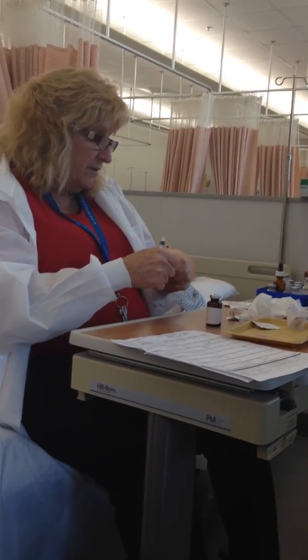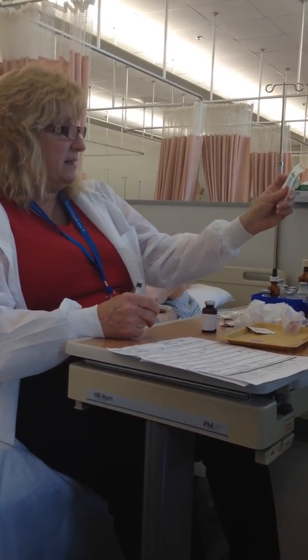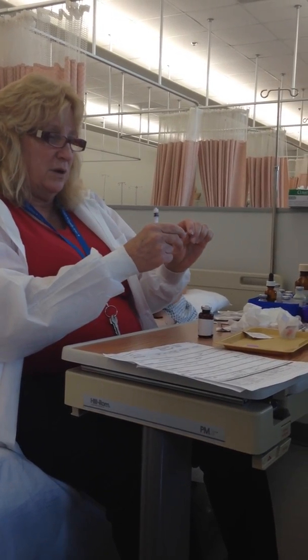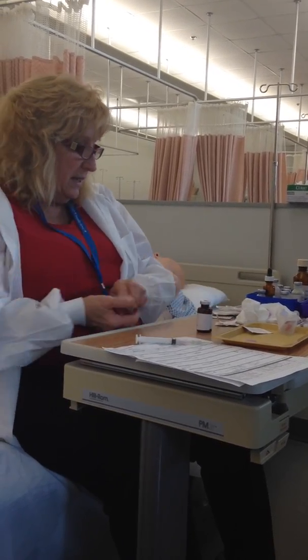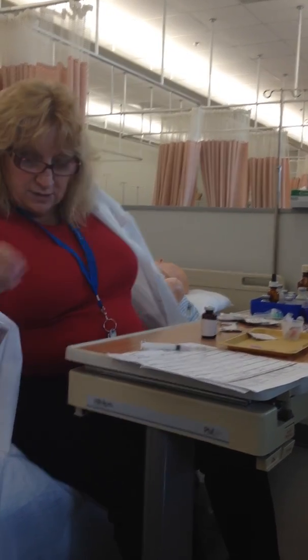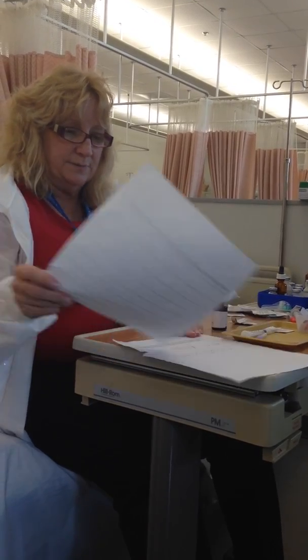Snap this off. Keep it in your hands. This is a different packaging. This packaging is like this, and the hub is inside there. This one has a sterile cover over the hub. You just take it off, and those are garbage. So you can put this in your pocket, so you can set it down after you've put the cap on it already. That's correct. Okay. Now I'm going to do my draw, and I have 2 milliliters.